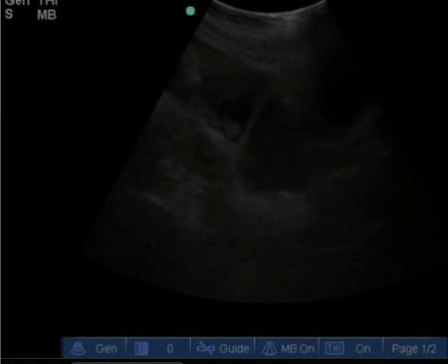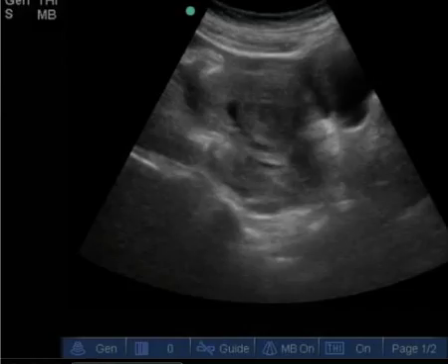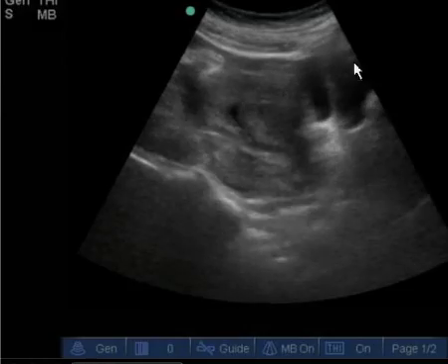So here is the bladder here. This is the uterus, but don't focus on that. And then you can tell that this is positive because you see a clear demarcation between the bladder and this is free fluid here. You need to see the bladder outlined, and illustration that there is also another anechoic structure to tell if it's free fluid or not.